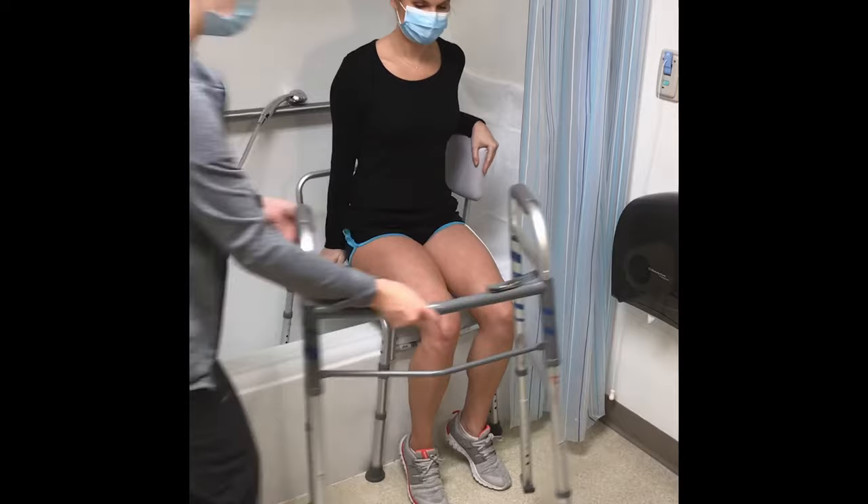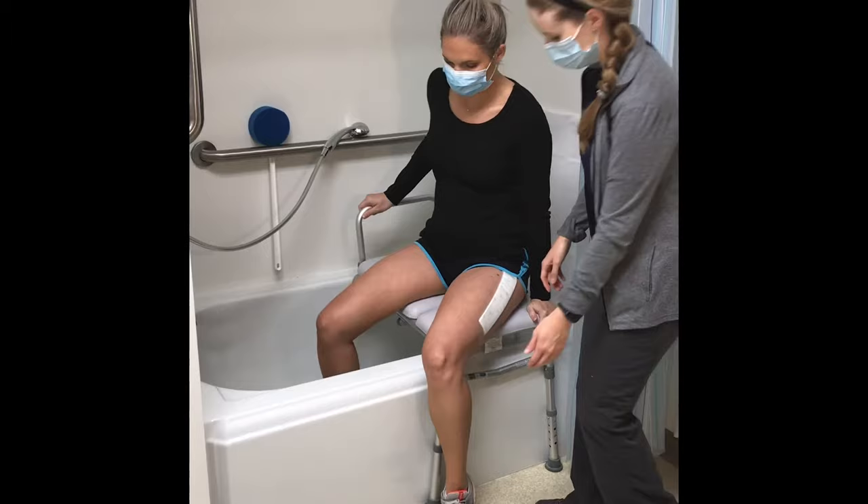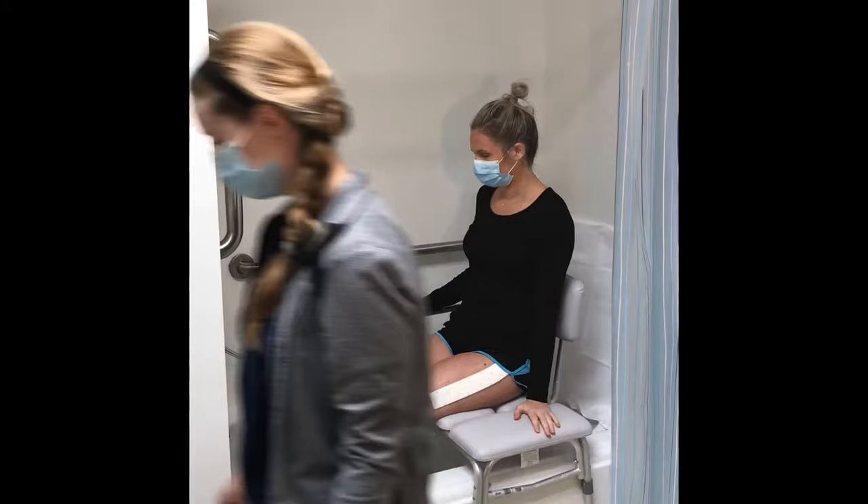Scoot back on the bench. Slowly and carefully turn your body to face the shower head while lifting your legs over and into the tub. Be sure to avoid bending or twisting your surgical hip. Keep your toe pointed up to keep your legs straight. Have a caregiver help bring your legs into the tub.